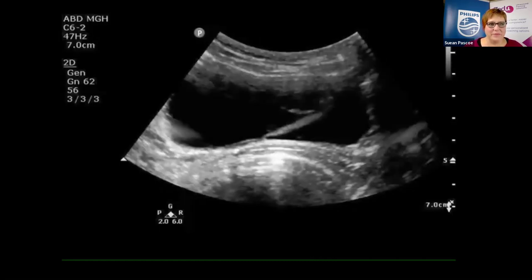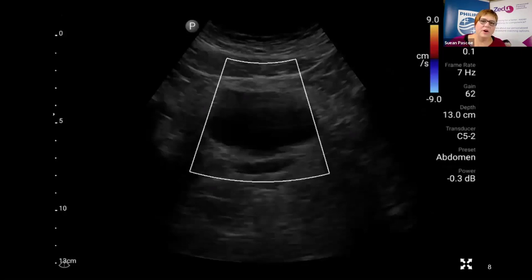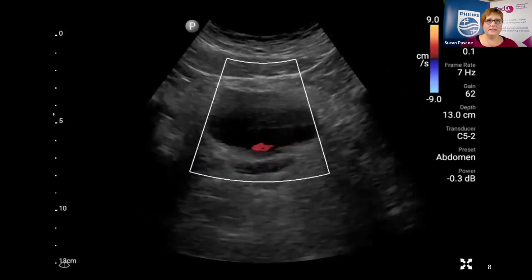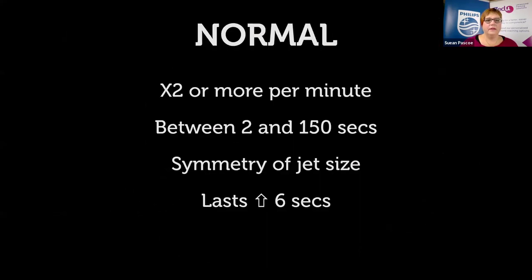On color, the jet of urine is of a high enough speed so that the frequency shift — the speed of the urine going past the ultrasound — creates a frequency shift and therefore you see a burst of color. Here again is a right-sided ureteric jet with that little burst of color. What is normal? It's thought we should see two or more jets per minute, occurring between two seconds and 150 seconds, with symmetry of jet size, and some studies suggest each jet should last longer than six seconds.